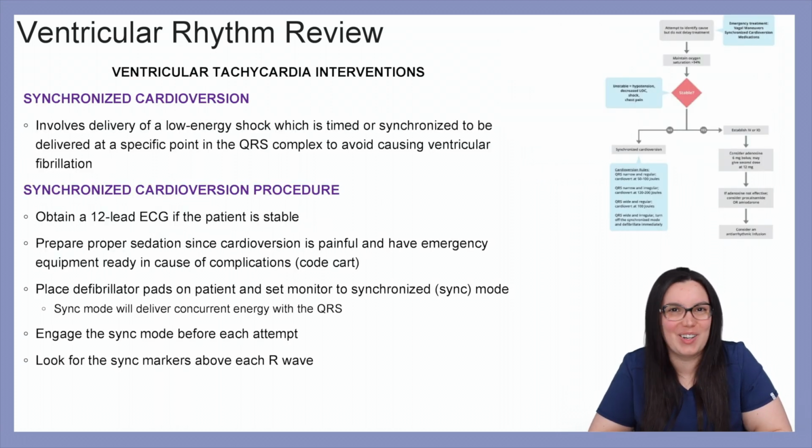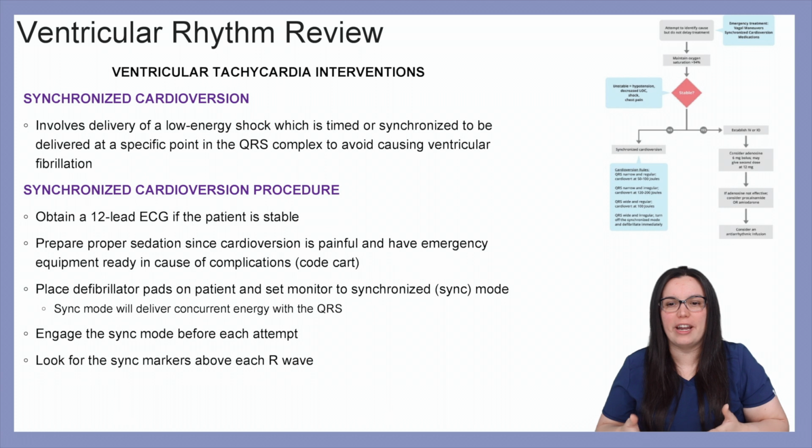So synchronized cardioversion is so much fun, not for the patient, but for you. It involves the delivery of a low energy shock, which is timed or synchronized to be delivered at a specific point in the QRS complex to avoid causing ventricular fibrillation. So how do we do this procedure?